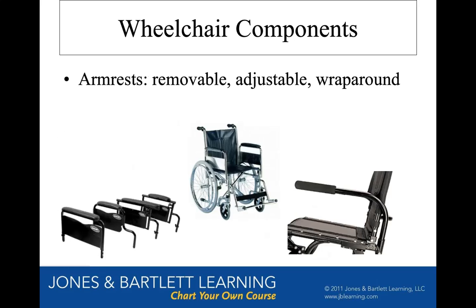Armrests, most armrests are removable. Very few are welded in place. They need to be removable so you can do transfers and get your patient out of them. You can see this chair on the right side of your screen that has a tubular armrest. The armrest looks like a tube.